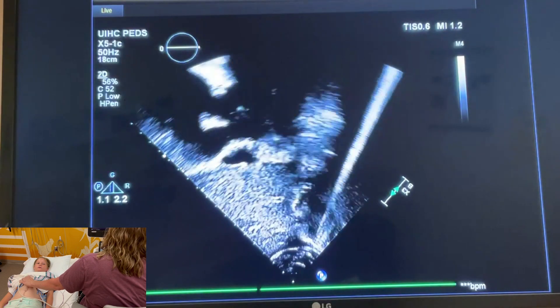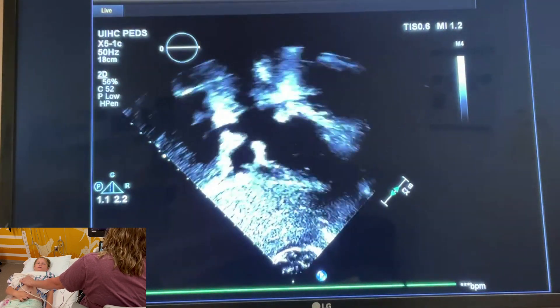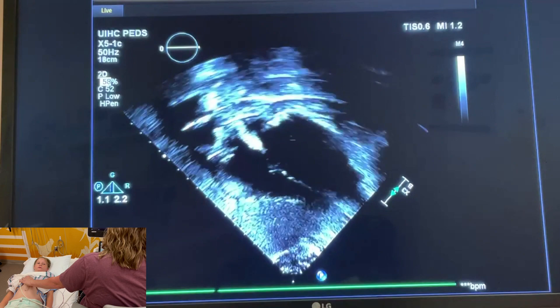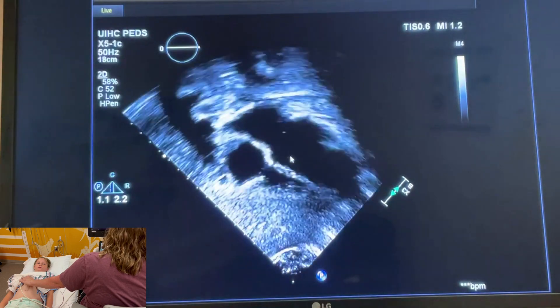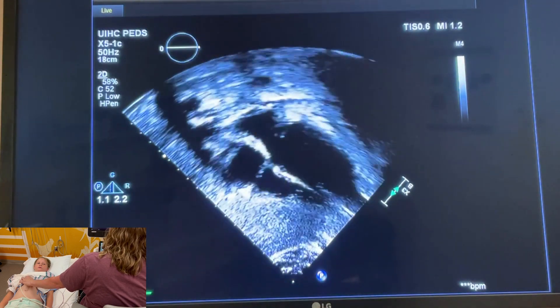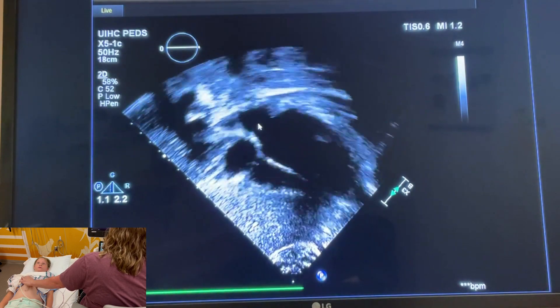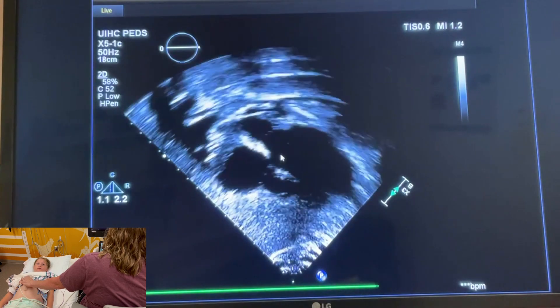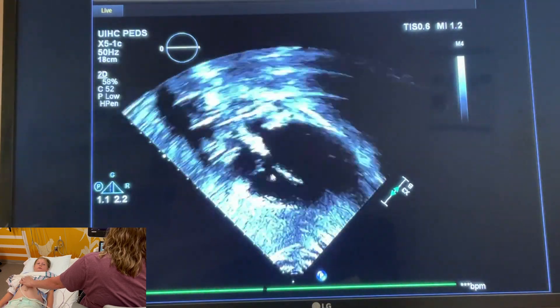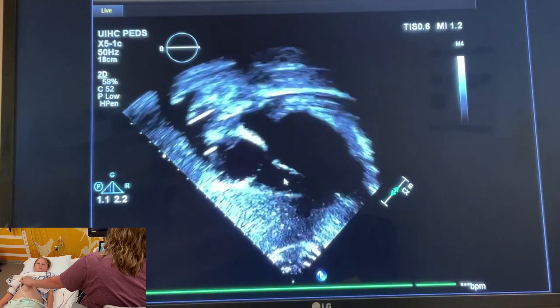There's the four chamber view. Here we have the right atria, left atria, and the interatrial septum. We've got the AV valves here, the interventricular septum, right ventricle, and left ventricle.